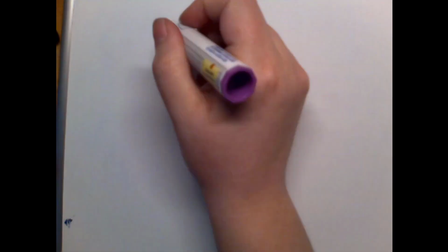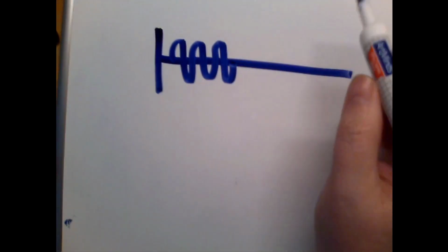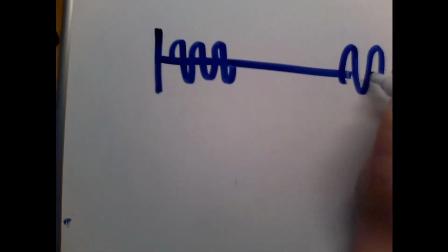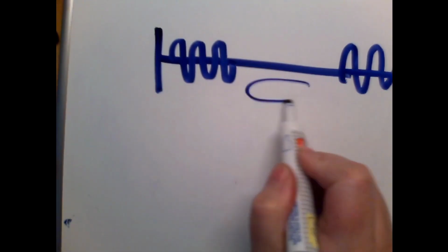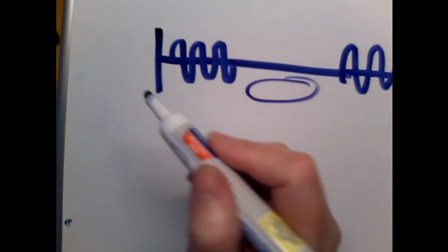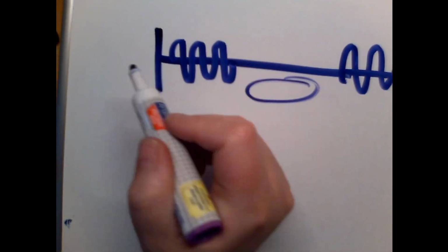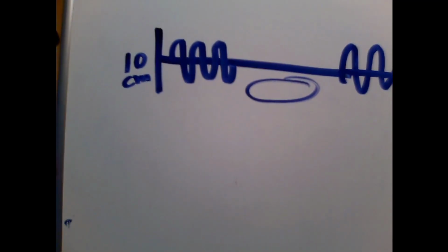Okay. So let's draw it out another way then. Again, we have our pulse, our off time, and the beginning of our next pulse. Remember that next pulse can't send until the echoes come back from the first pulse. So let's say this first one is set to be 10 centimeters depth.